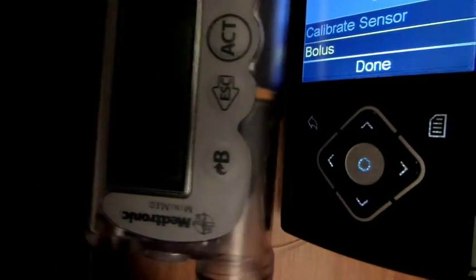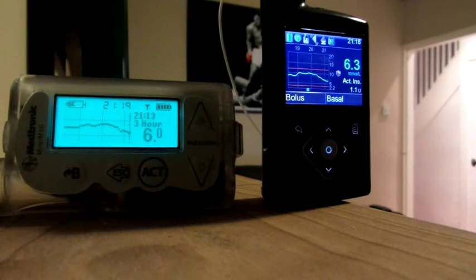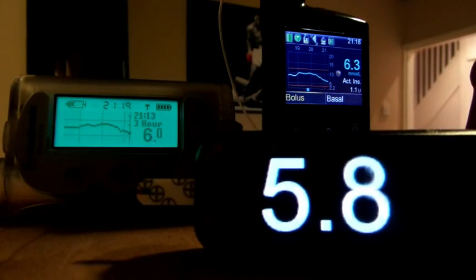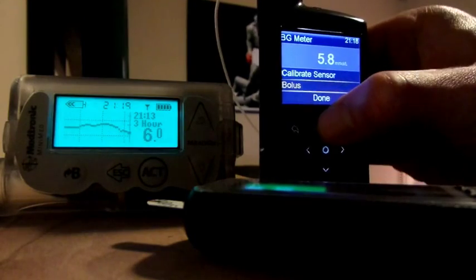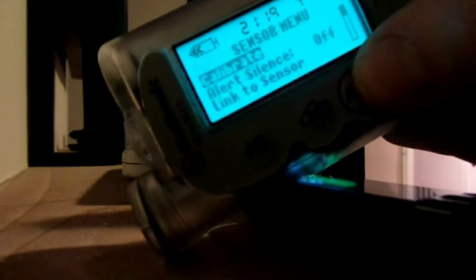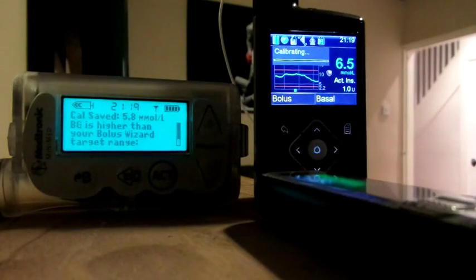Let's see how they both go on the first night. Calibration before bed — both still look like they're tracking very similar. 5.8, so it's all pretty close. Sent through, calibrate this here, and calibrate this here also. We'll see if the SmartGuard comes into action tonight. Going to bed — one unit of active insulin left on board, 6.5.